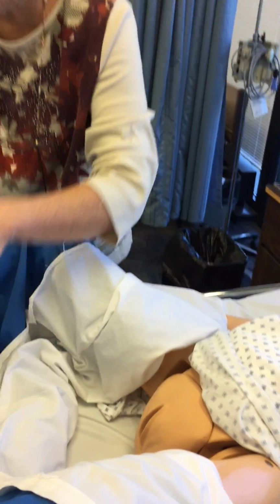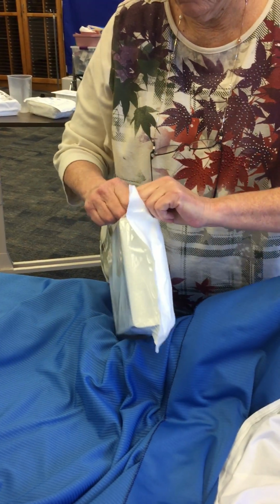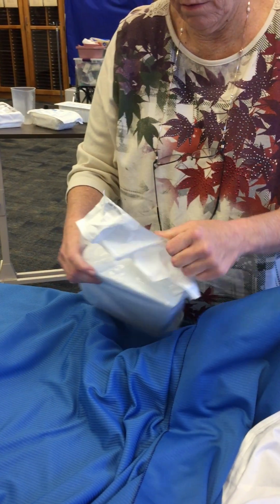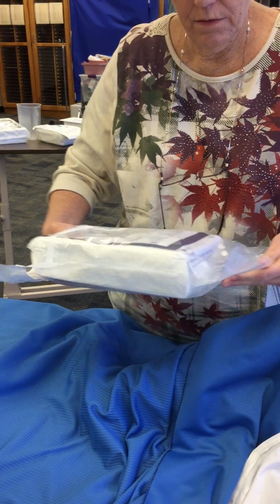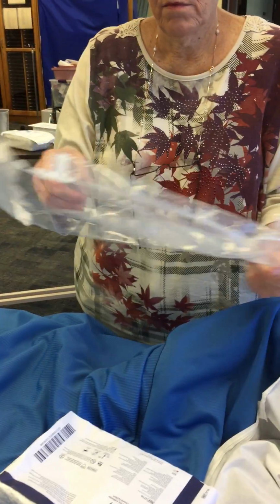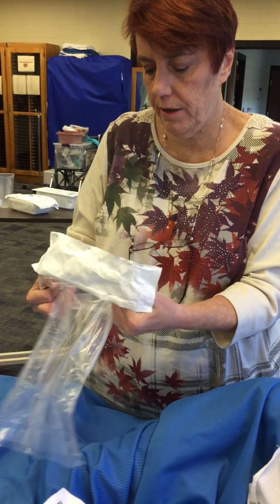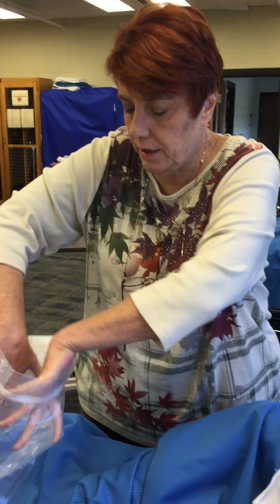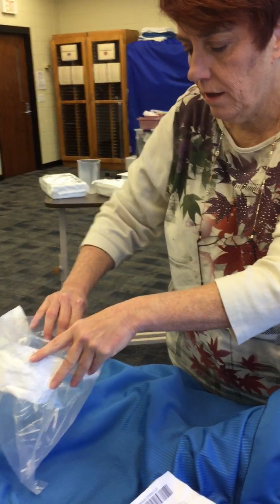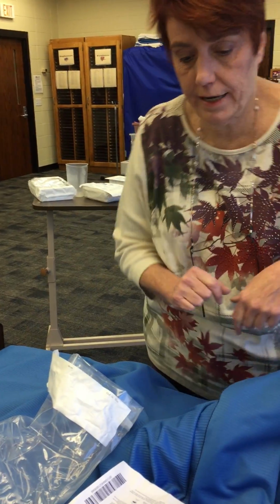We're going to work on opening our catheter kit. This is waterproof plastic, the package that your catheter kit comes in. It's not garbage. It's to be used for your garbage when you're getting ready to put your catheter in. So cuff the bag and keep it right here handy.